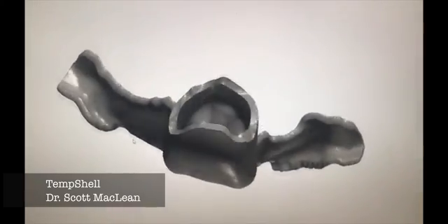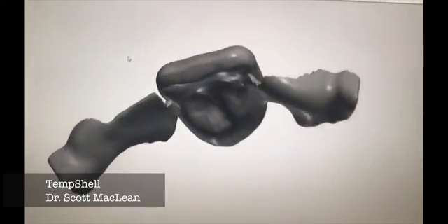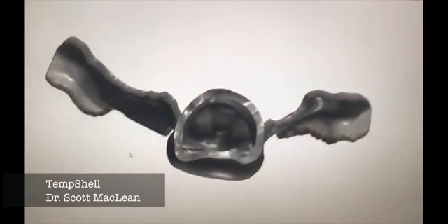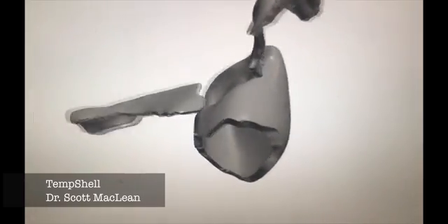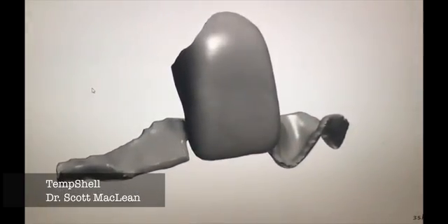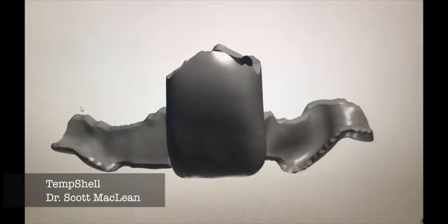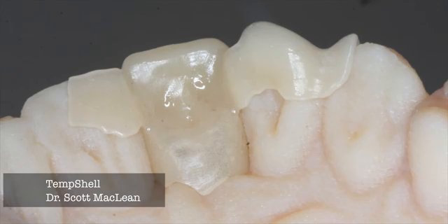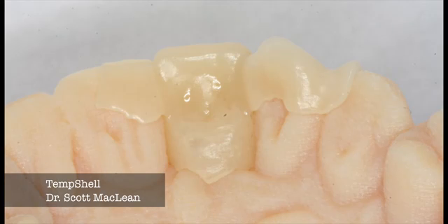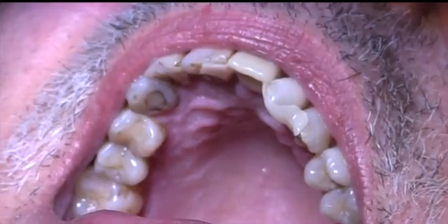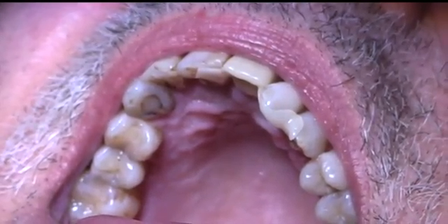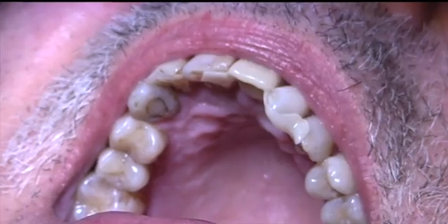The temp shell will be ideally positioned so I'll use a template to position the implant, then use the temp shell to go on top. Putting these all together, we know exactly where we're going at the time of surgery — predicting where the soft tissue is going to be and where the implant is going to be. On the printed model, the temp shell is lined up using the adjacent teeth. Once I start the case, I'll place this in the patient's mouth and verify that it does fit.